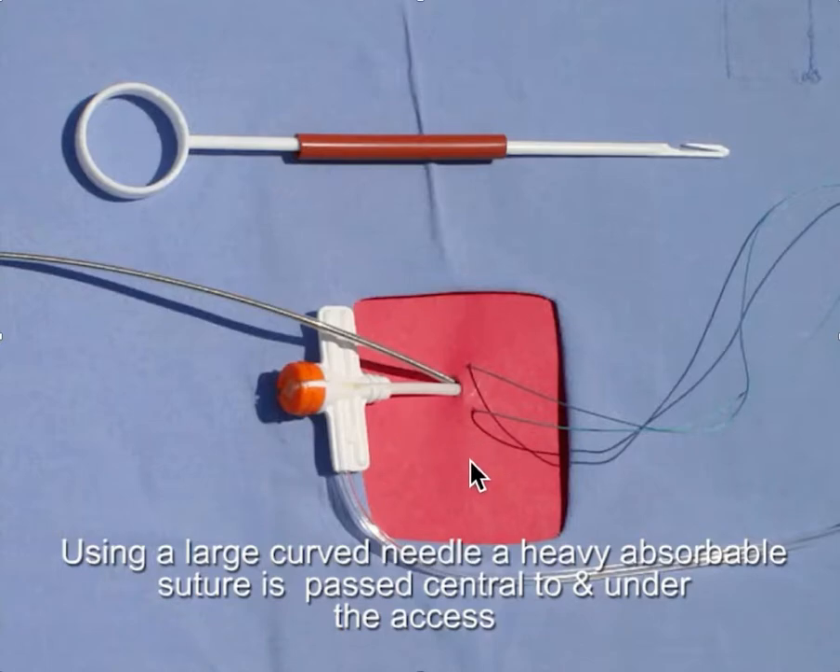The idea is that you use a curved needle and an absorbable suture is passed central and under the access. You want to make sure that the entrance point with a big curved needle goes under and then comes back out over here. And you have this absorbable suture.